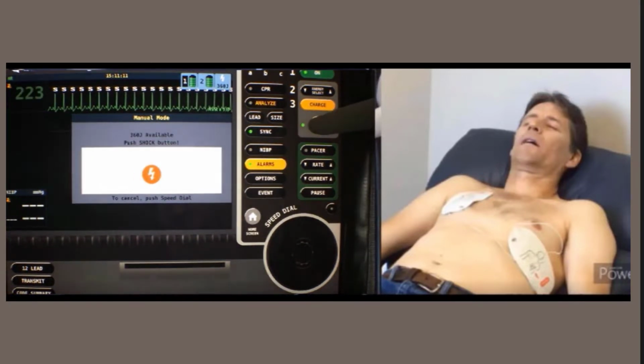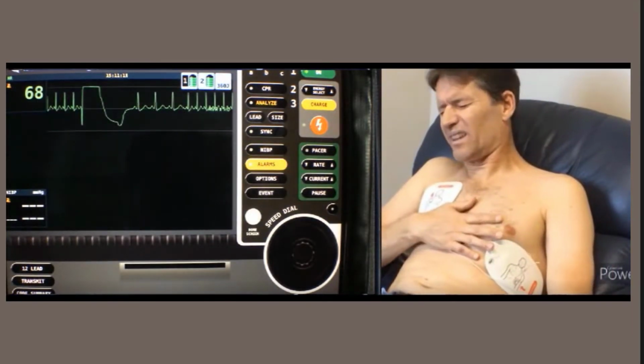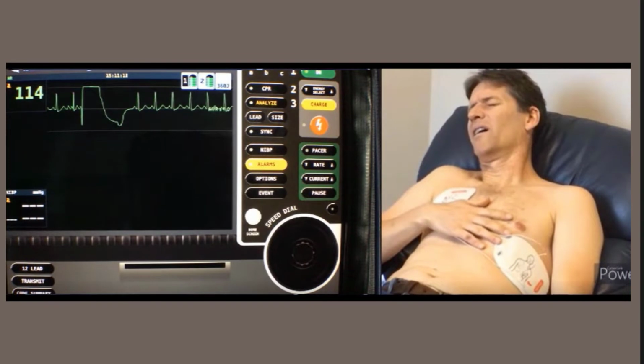We provide an all clear, and now we would go ahead, check the GCS, ensure that we've got adequate oxygen saturation monitoring and that we're providing any other supportive treatments we need to. This may include the administration of some analgesia.